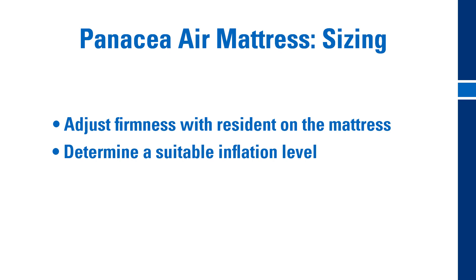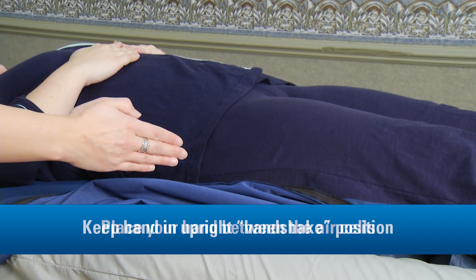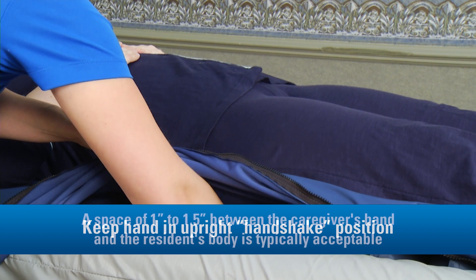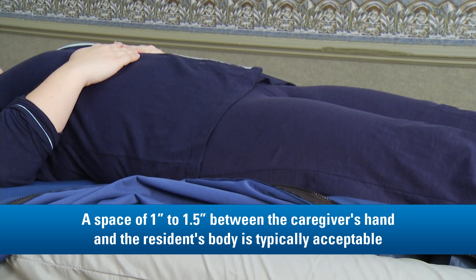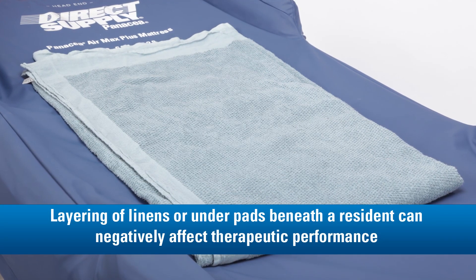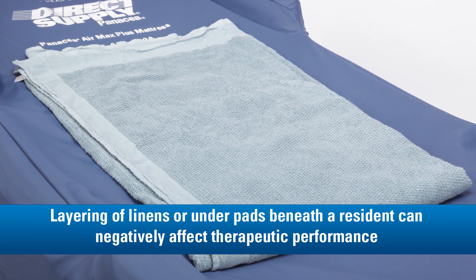A common method for determining a suitable inflation level is to slide one hand into the mattress between the air cells beneath the resident's buttocks, keeping your hand in an upright position similar to if you were going to shake hands with someone. A space of one to one and a half inches between the caregiver's hand and the resident's body is typically acceptable. Please keep in mind that multiple layering of linens or under pads beneath the resident can negatively affect the therapeutic performance and should be avoided unless recommended by a caregiver.